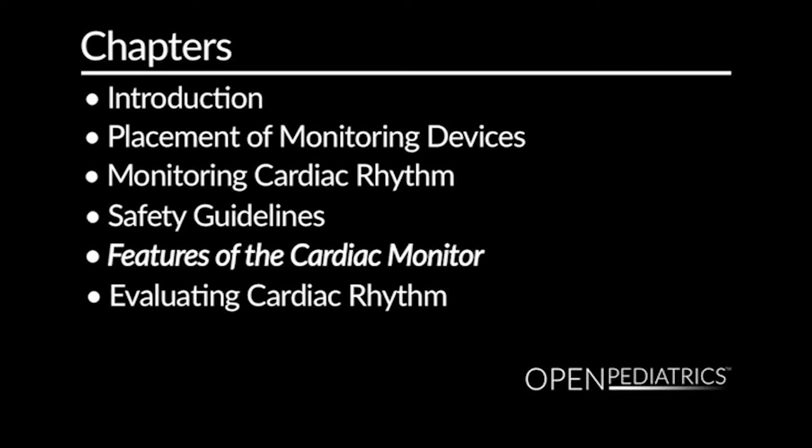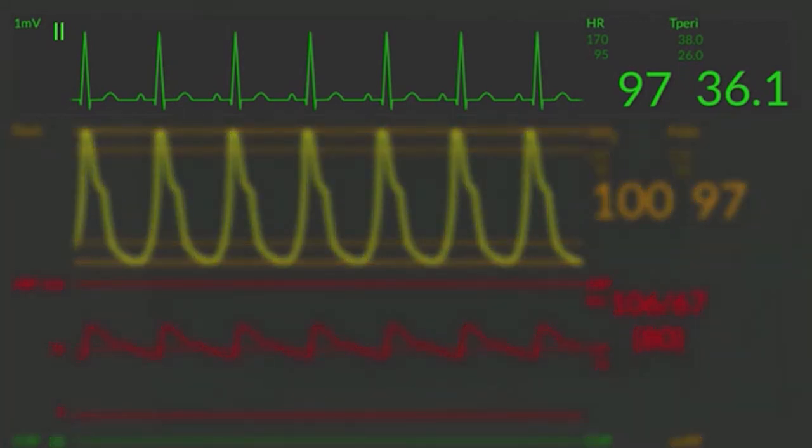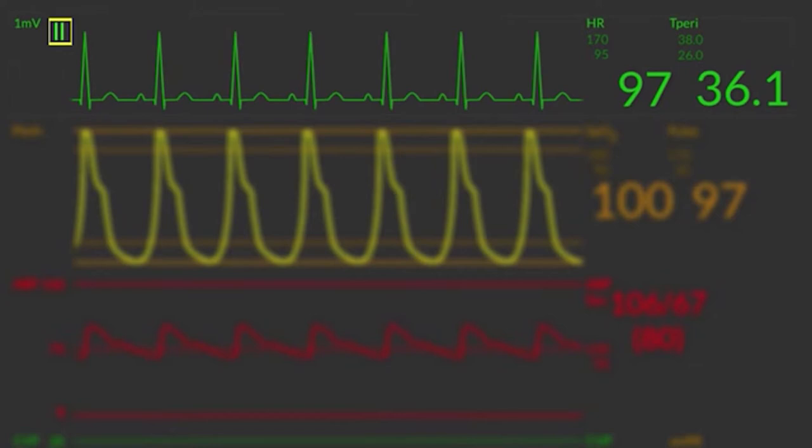Now we'll take a better look at the monitor. You'll notice the top line is the green line, which gives you heart rate and heart rhythm. At the very top left corner, the monitor tells you which lead view you are in. Typically there are three views: lead one, two, or three. If leads are placed appropriately, lead two is typically the most accurate view. You can flip through each of the different views to get the cleanest rhythm on your monitor, as different views can be useful in gaining different information.